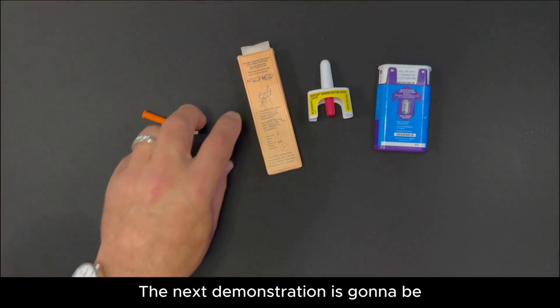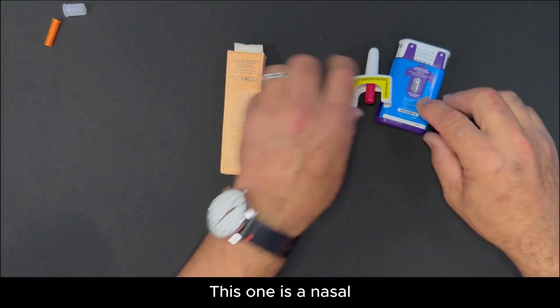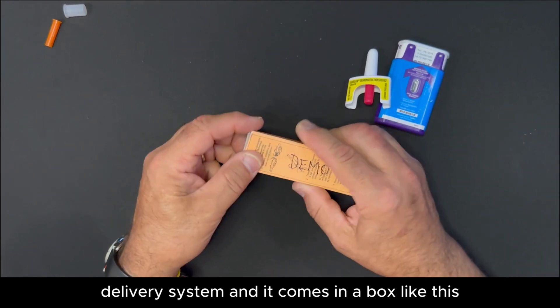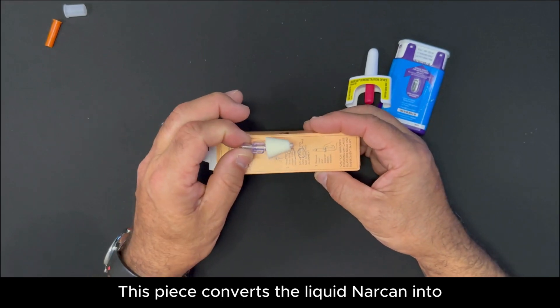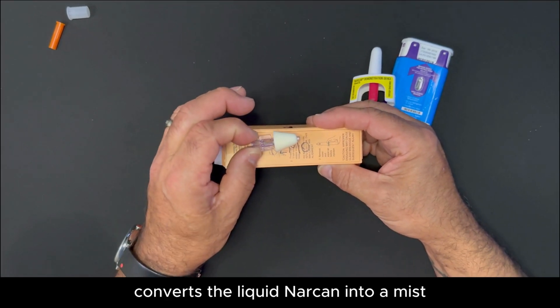The next demonstration is the nasal delivery system, and it comes in a box like this. The only thing you're going to see different is this piece — it's called the atomizer, which converts the liquid Narcan into a mist.